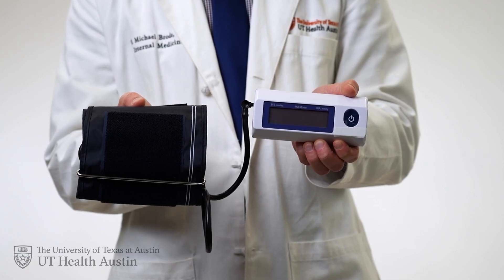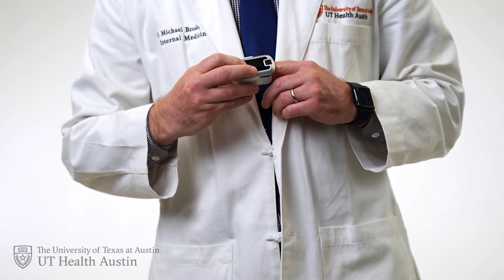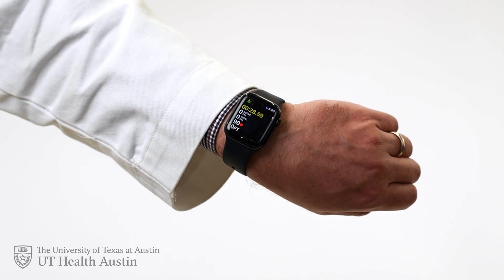First of all, gather your materials. You will need a blood pressure monitor. Both a wrist or an arm monitor work perfectly fine, as we are interested in how the blood pressure changes, not necessarily if they are perfectly accurate. You'll also need a device to measure your heart rate, like a pulse oximeter, a fitness tracker, or a blood pressure monitor if it has that heart rate feature. You'll also need a place to lie down like your bed and a wall to lean on for standing measurements. This test will take about 20 minutes total to complete.